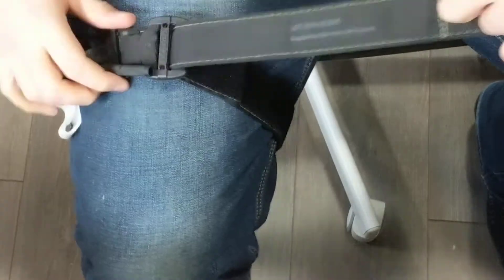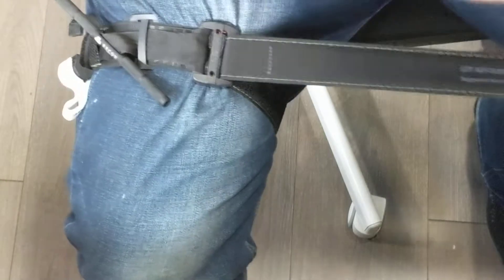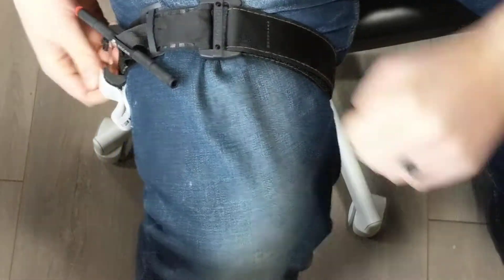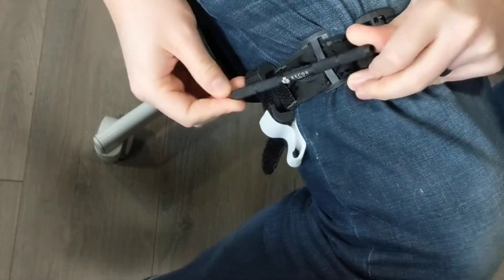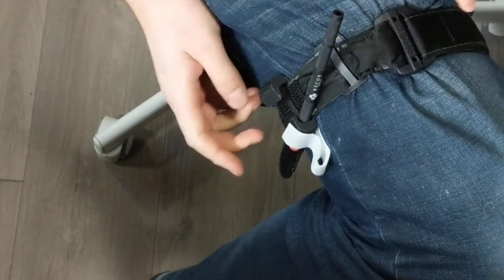This finger hole makes it really easy to pull on and get a nice tight grab. You got your windlass here. You're going to twist until you have the bleeding controlled. The catch grabs it nicely.